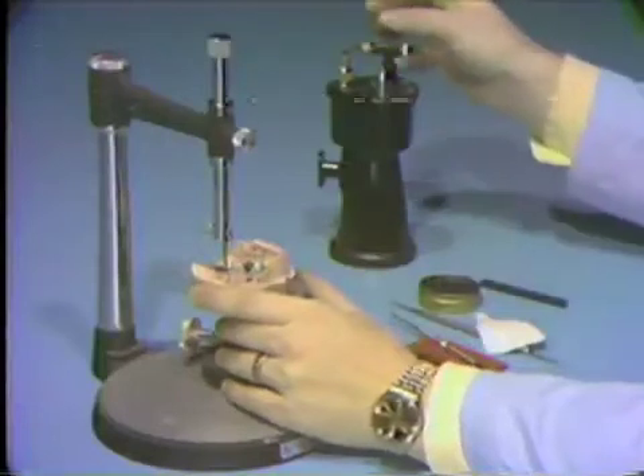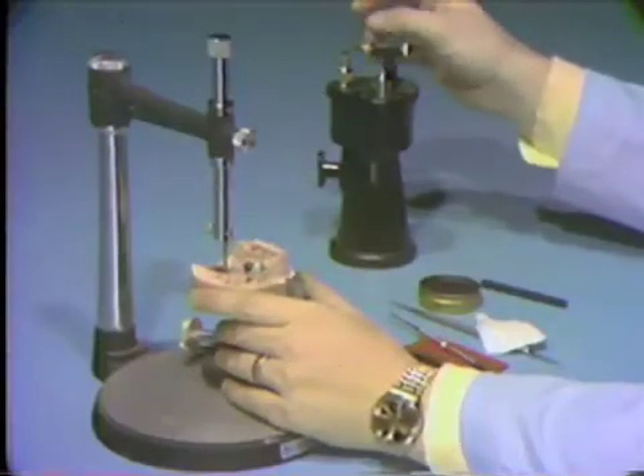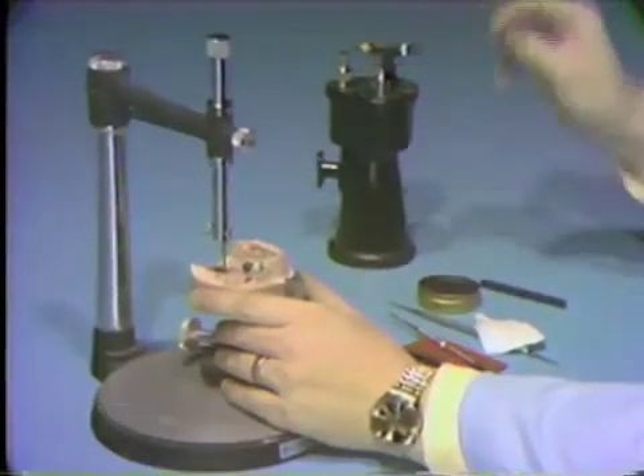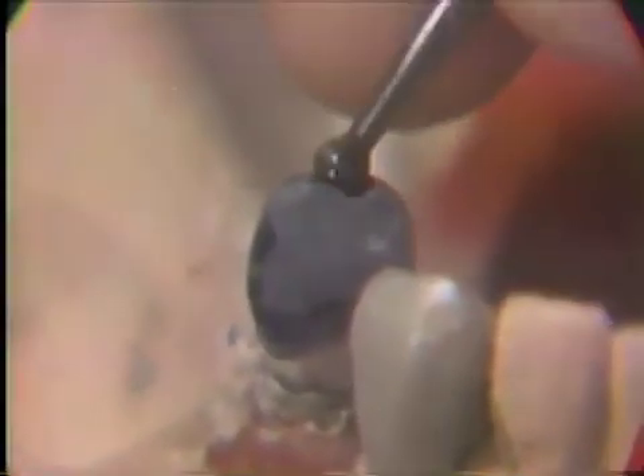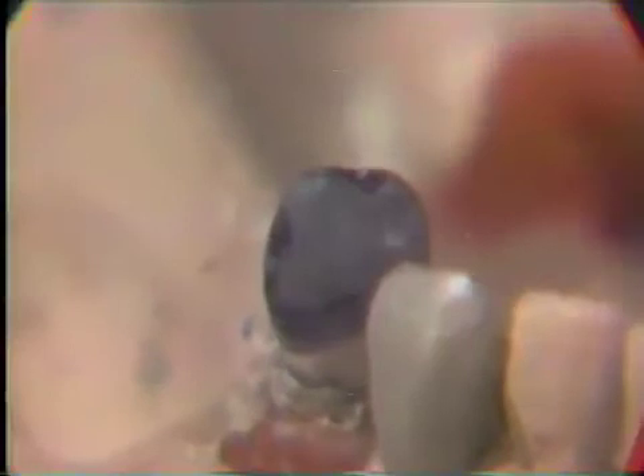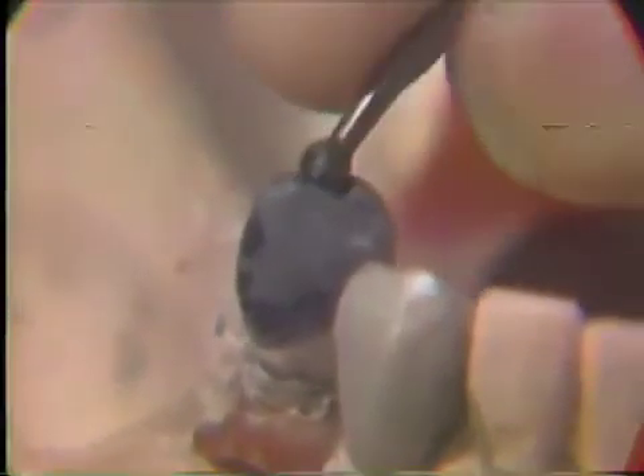An occlusal rest seat must be prepared on the distal occlusal surface of the crown wax up. The best and easiest method of creating this seat is to use a warmed number eight straight handpiece round burr and slowly rotate it with your fingers to carve away the wax. Be sure to reduce the marginal ridge area also. The finished occlusal rest preparation should be slightly deeper than the marginal ridge area.